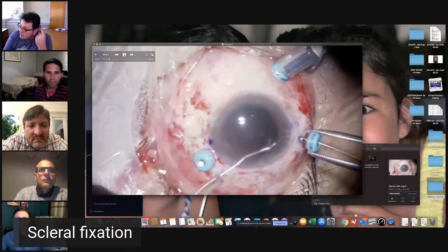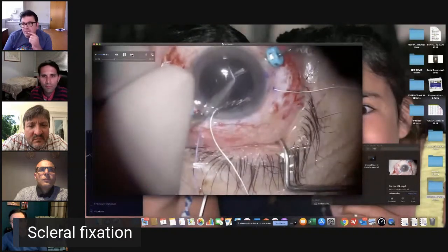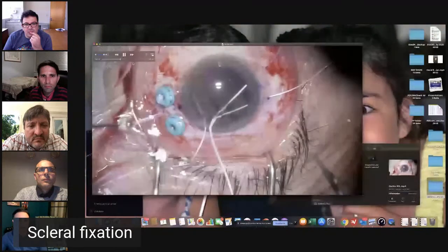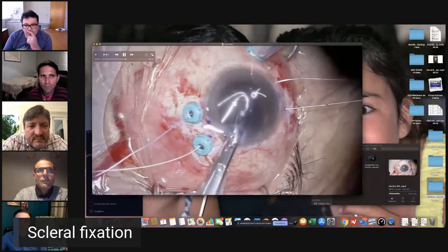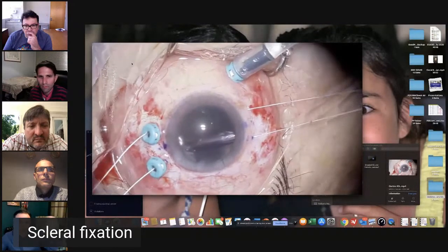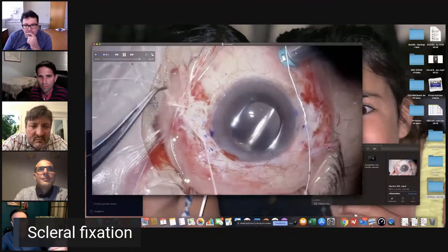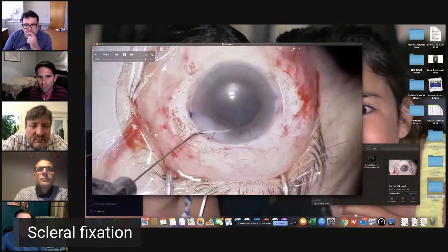Okay, sorry. No worries. This is a little bit more controlled, everything a little bit easier to manipulate. Again, as I said, the important thing in these cases is to mark your loops and know what's inferior, what's posterior, what's left, what's right. Once you get going, it's easy. But as with everything, you have a learning curve that you need to be aware of.